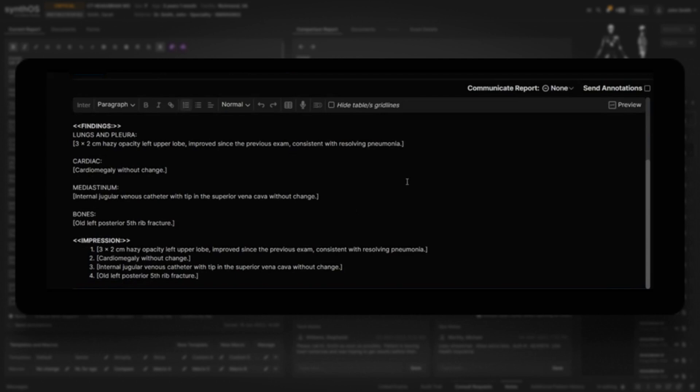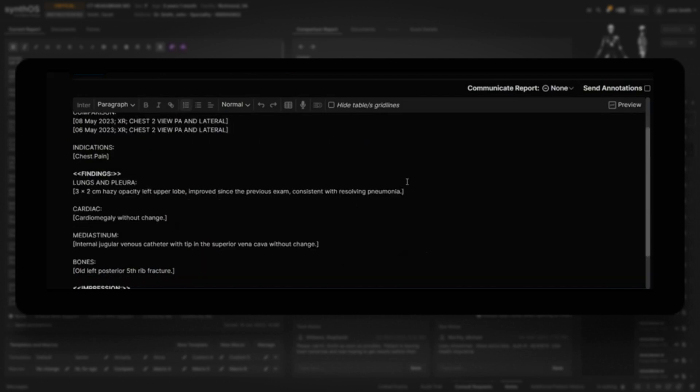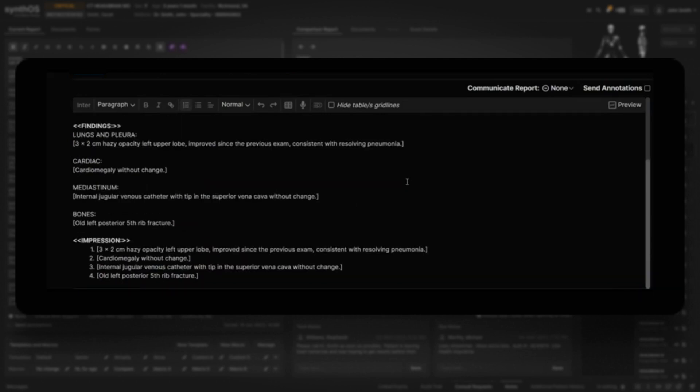That is amazing. All findings parked in the right place. Abnormalities summarized in the impression. Absolutely amazing.